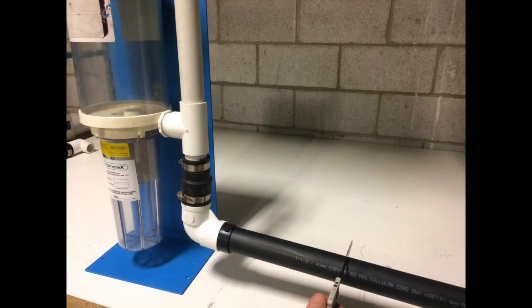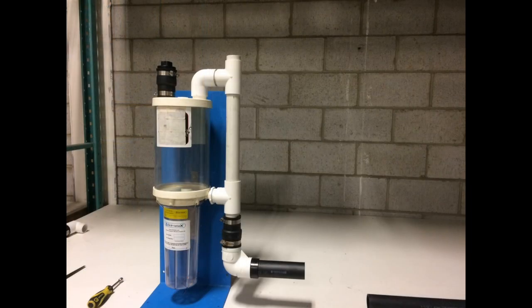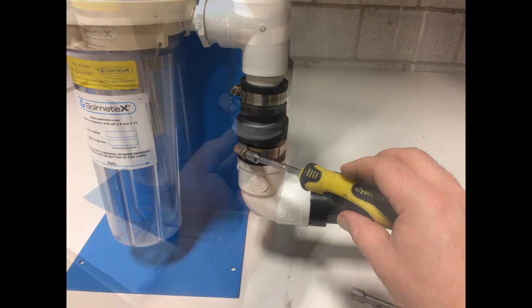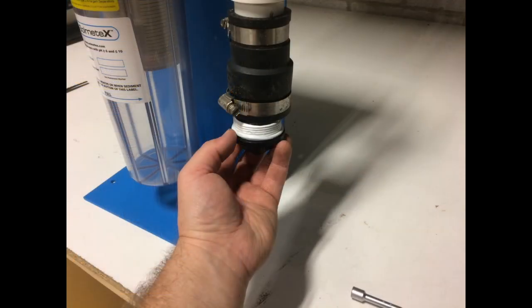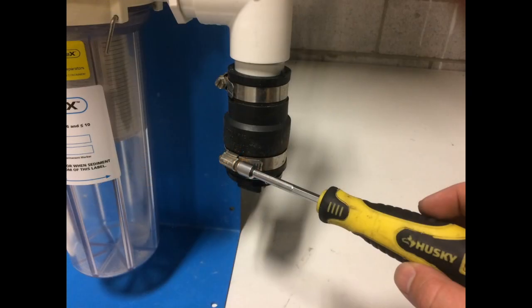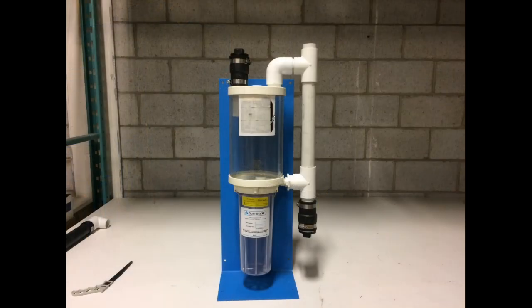Tighten the hose clamp on the rubber coupler securing the closeout plug. Similar to the process completed on the inlet, cut the outlet pipe leading to the suction pump. Pull the amalgam separator away from the cut outlet pipe. Loosen the hose clamp on the rubber coupler on the detached pipe, insert the supplied closeout plug, and tighten the hose clamp on the rubber coupler securing the closeout plug in place.